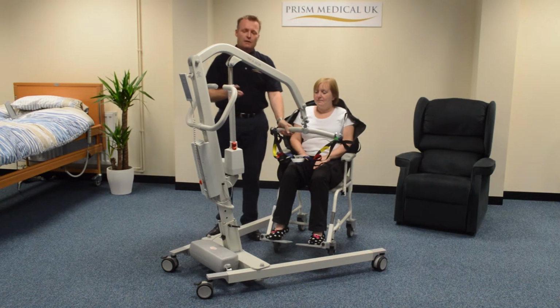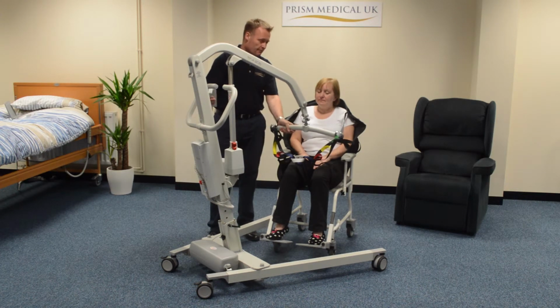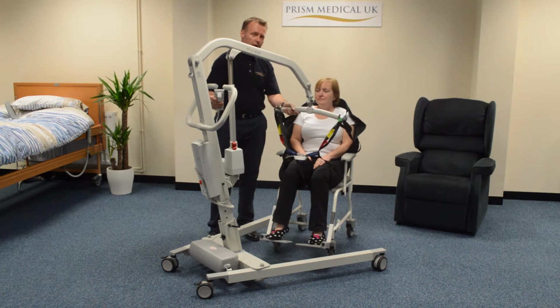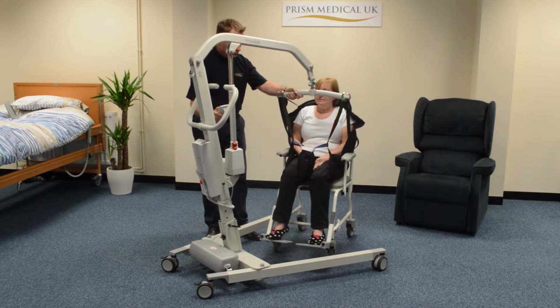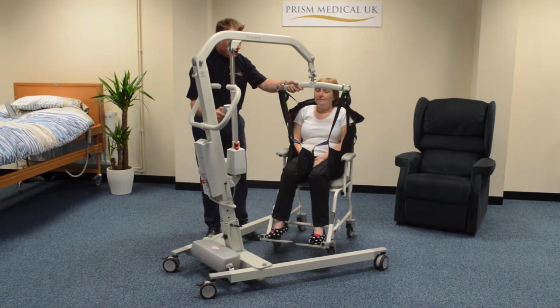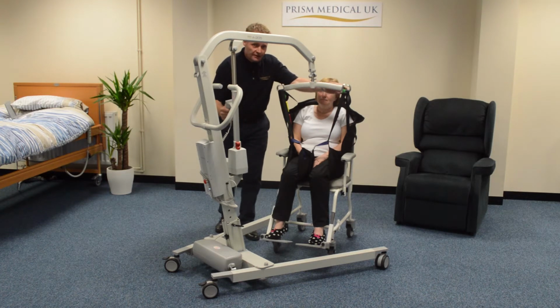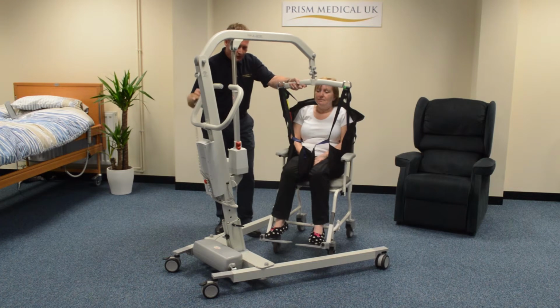Once all the straps are in position, we raise the carry bar to take the tension on the straps. Once the tension is on the straps, but before it's actually started to lift Mary, we just go around and we just ensure that all the straps are in the correct places, in the correct orientation. Once we're happy with that, we proceed with the lift.